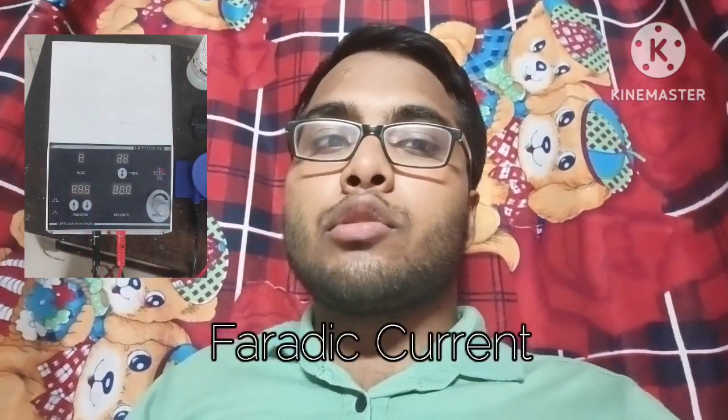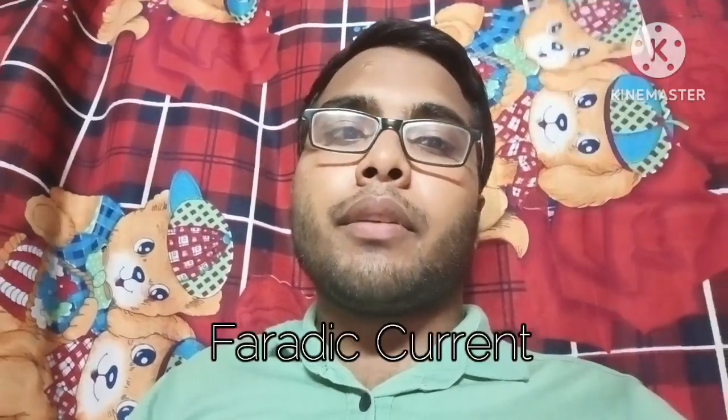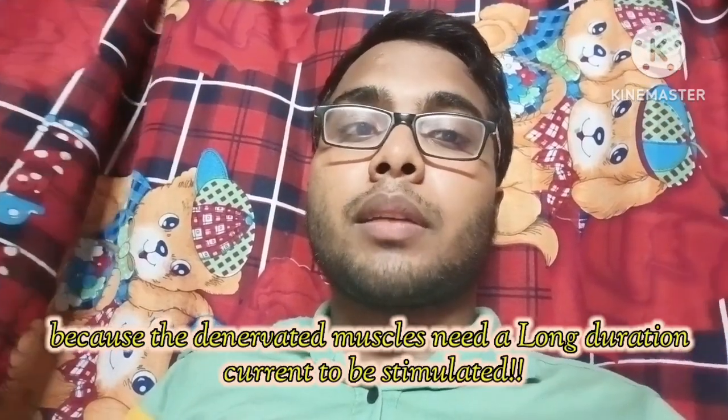Faradic current is a short duration interrupted direct current. Short duration means the pulse duration is 0.1 to 1 millisecond, and the frequency of the Faradic current is 50 to 100 hertz. Faradic current is used in surge form to produce tetanic contraction and relaxation. And one thing, the Faradic current is only applicable in innervated muscles. Innervated muscle means the muscles whose nerve supplies are intact.